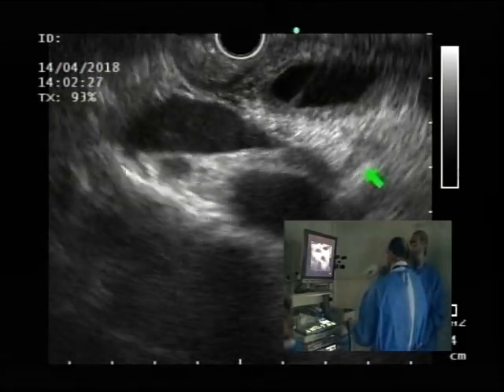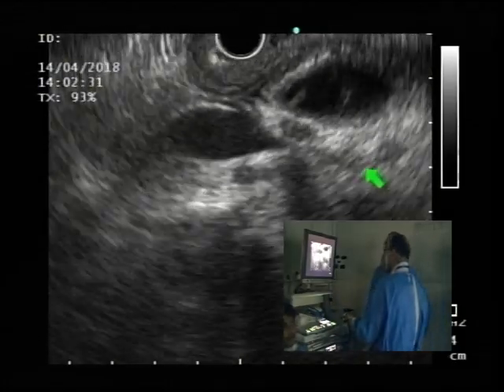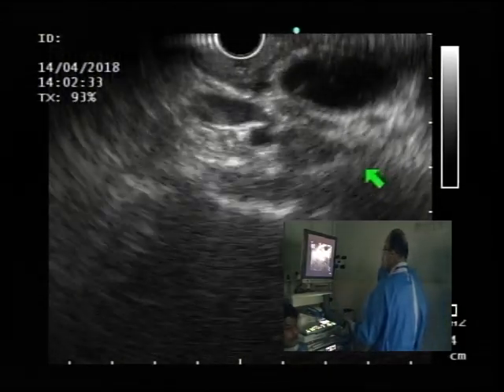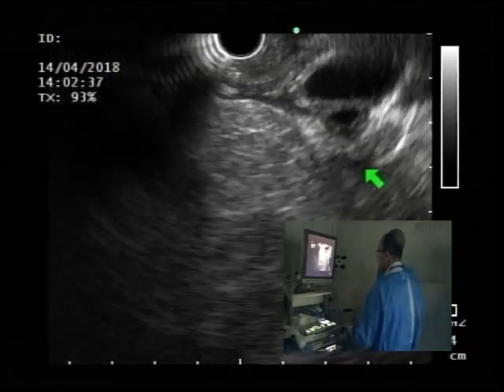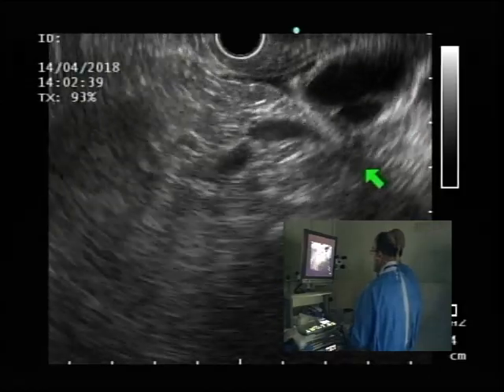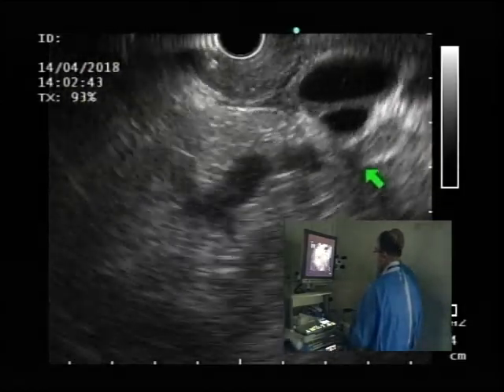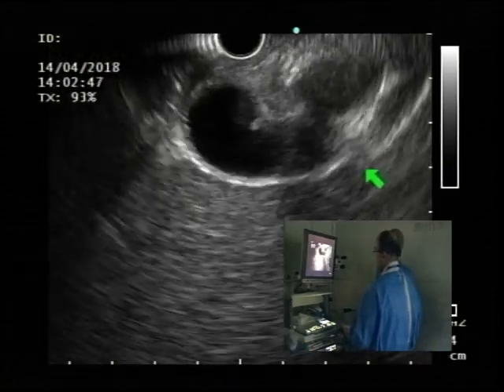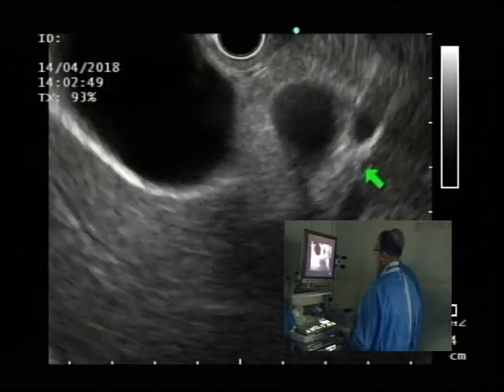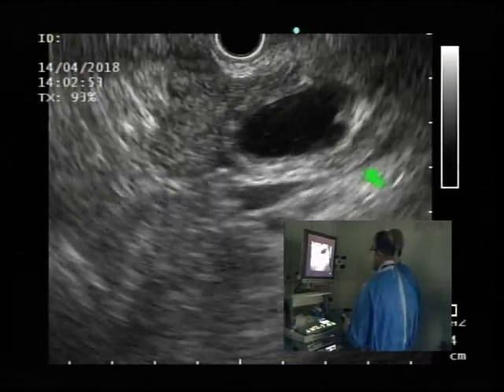So yeah, this is the bile duct. If I keep going counter, I will go towards the liver, and you may be able to follow the bile duct all the way up into the hilum. So that's the cystic duct below it. And now we're in the hilum. Gallbladder has come. Now I'm going clockwise.